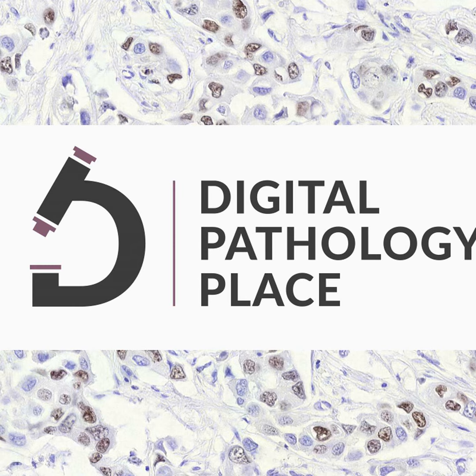So there's so much variability where I don't know if it just doesn't work because I've implemented it differently than they intended, or does their algorithm just not work on my specific data set, or where's this disconnect? Now, once we've released the code, we say, this works on this data. Here's the code, here's the data, try and redo it yourself. And you can. You click run, you wait sometimes a few hours, sometimes a few minutes, sometimes a few days. You come back, wow, this did work on this. Okay, I now know that something is working.